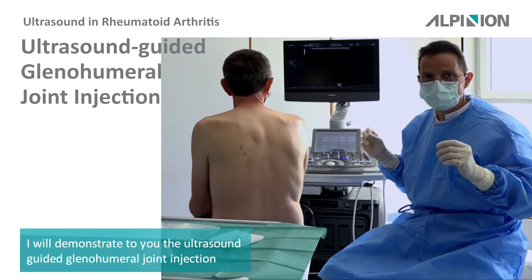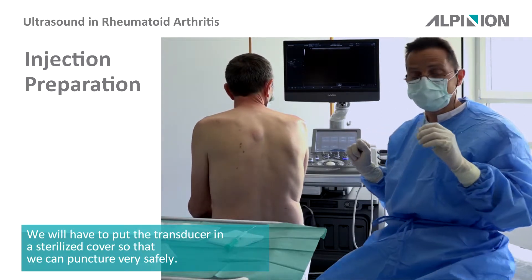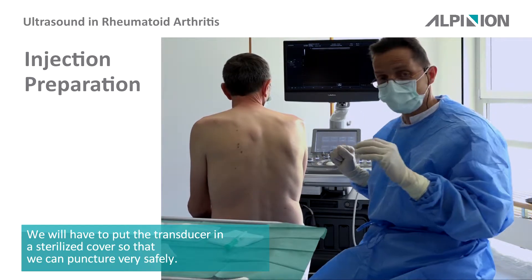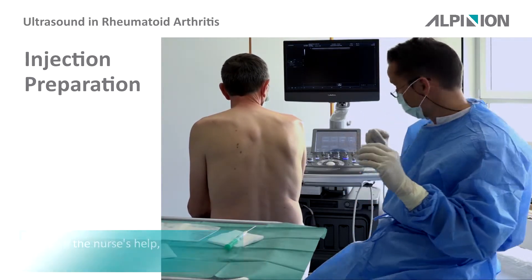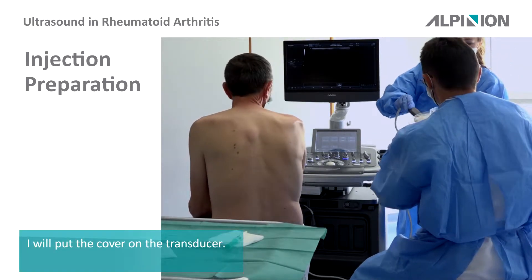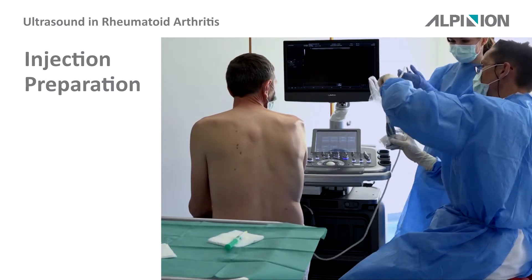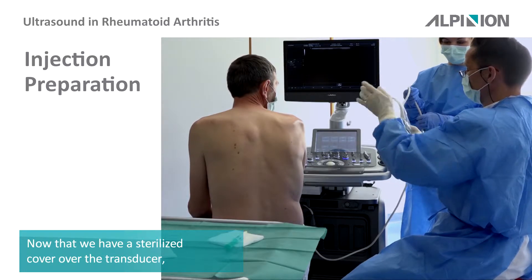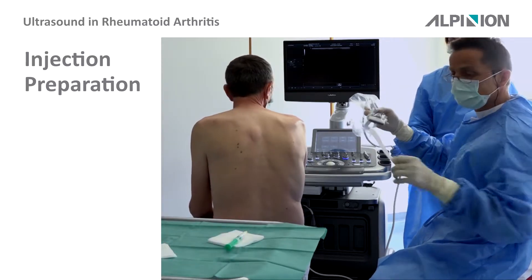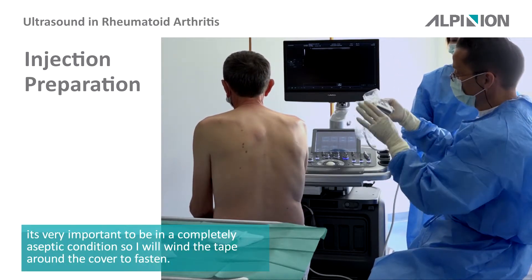I will now demonstrate a puncture of the glenohumeral joint. We have to put the transducer in a sterile cover so that we can puncture very safely. The nurse will help put the cover on the transducer. Now we have the sterile cover over the transducer — it is very important that everything is in an aseptic condition.